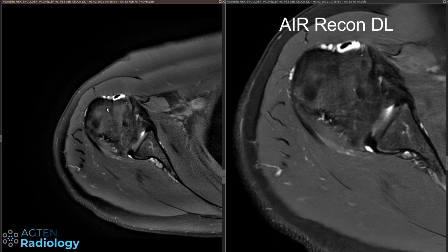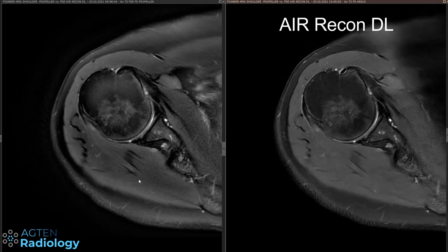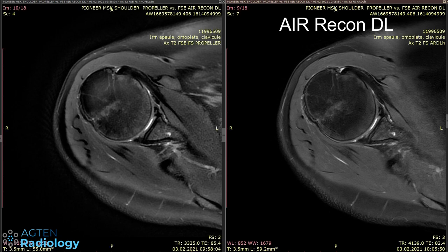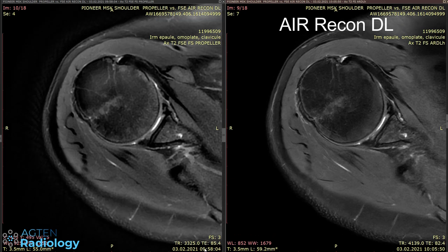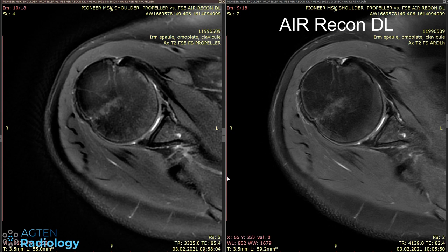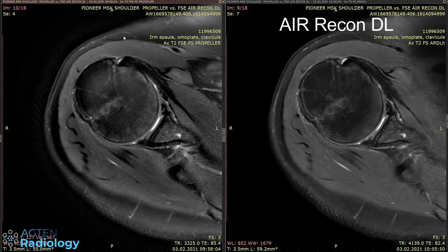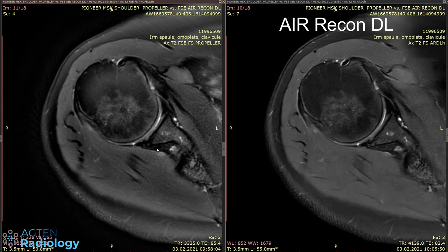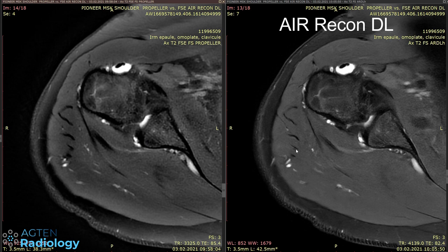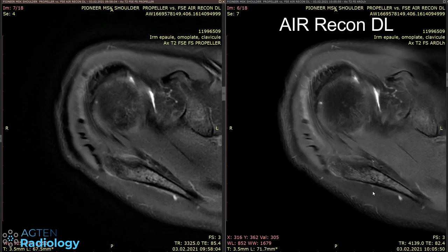There is also a propeller sequence here, and this one is more like what you would expect on a clinical scanner. So this one is without Air Recon DL, and this one is with — we can also see this from the timestamp, it's a separate sequence. This would be the real comparison because the other sequence was very noisy, probably a little noisy on purpose to really show the effect. But comparing to the propeller sequence, the enhanced image looks pretty nice with all the same information, even a bit sharper especially around vessels.